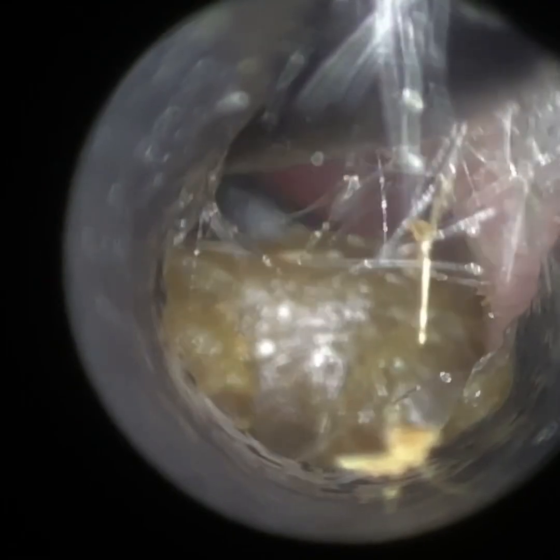The hook goes in and I've just got to manipulate it. I'm just gliding it horizontally at the roof of the ear canal — I'm in and behind, embedding the tip into the wax, slowly bringing it forward. It's just got trapped near the entrance now.